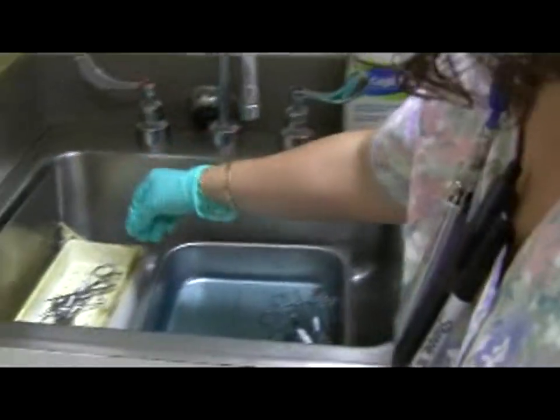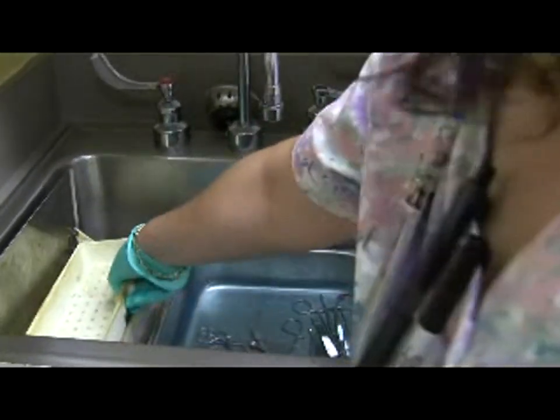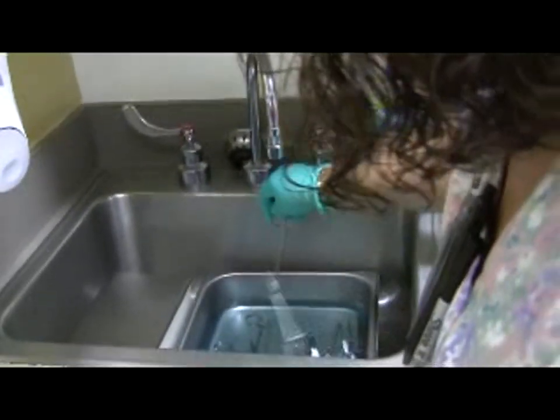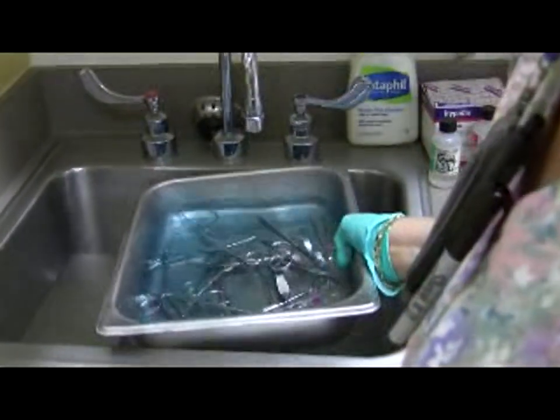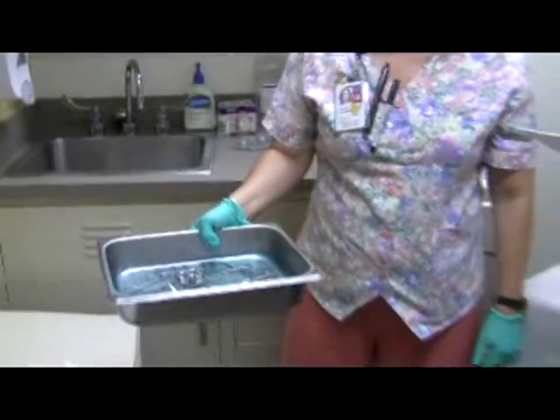If there are four or five instruments, you can pick up the basket and dump the whole thing in — that's the safer way of doing it instead of sticking your fingers with sharp scissors. You can also hold through the loops. However you do it, you should do it without sticking yourself.